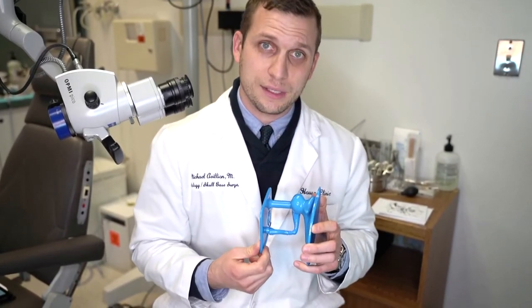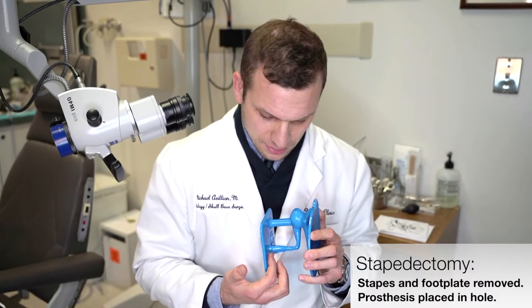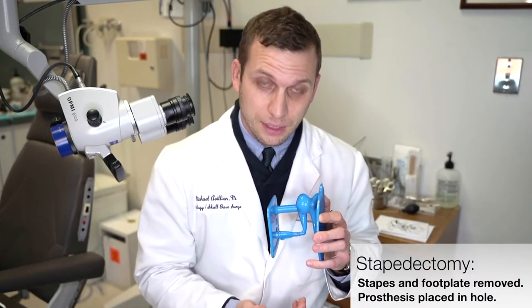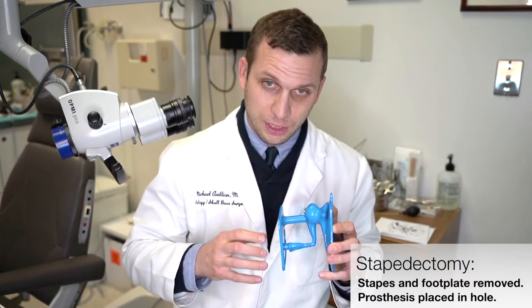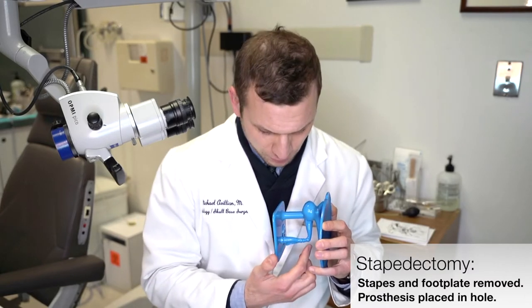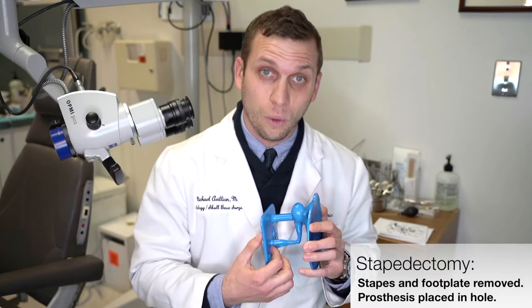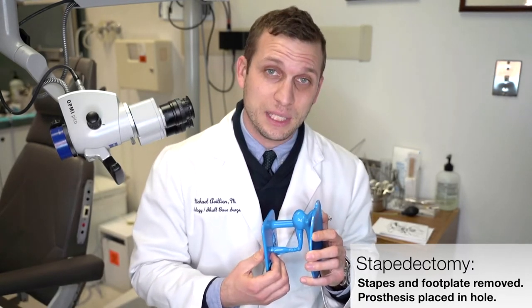There are two ways that the procedure can be done. One way is the stapes and the footplate is removed entirely, and there is an opening to the inner ear. Then a prosthesis is placed from the incus into that hole where the footplate used to be. That's called a stapedectomy.